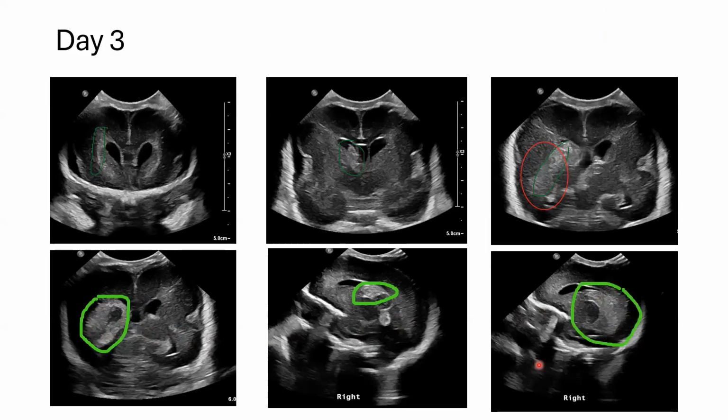Can I ask something? Yes, please. Is it usual to see unilateral grade 3 to 4 in a preterm baby? Usually it is bilateral. If it is unilateral, is it not reason to suspect that maybe this is a stroke, not a usual IVH for a preterm?